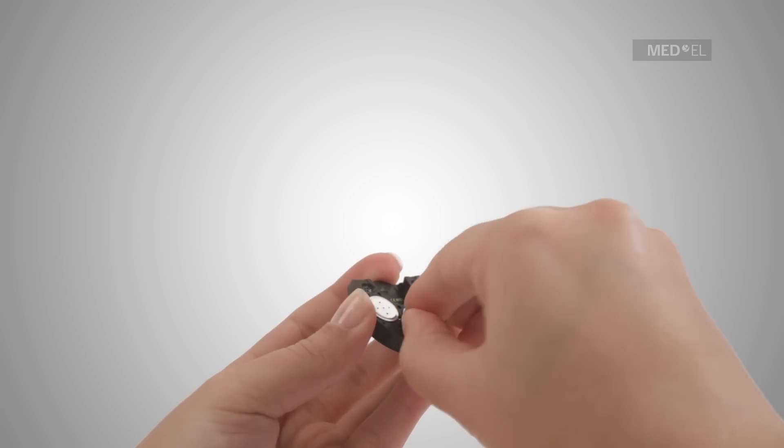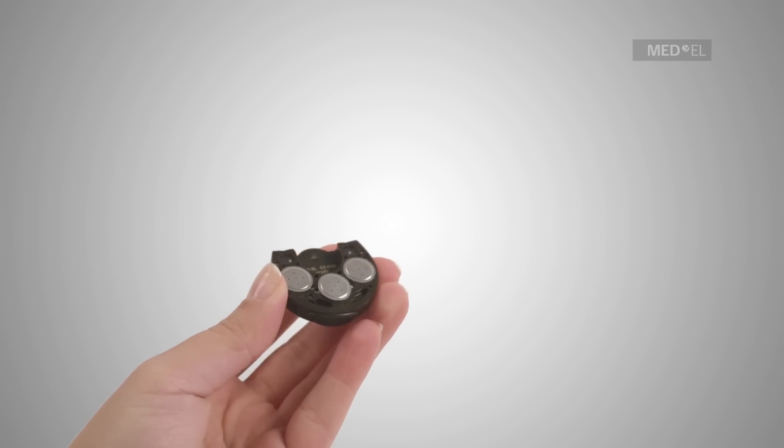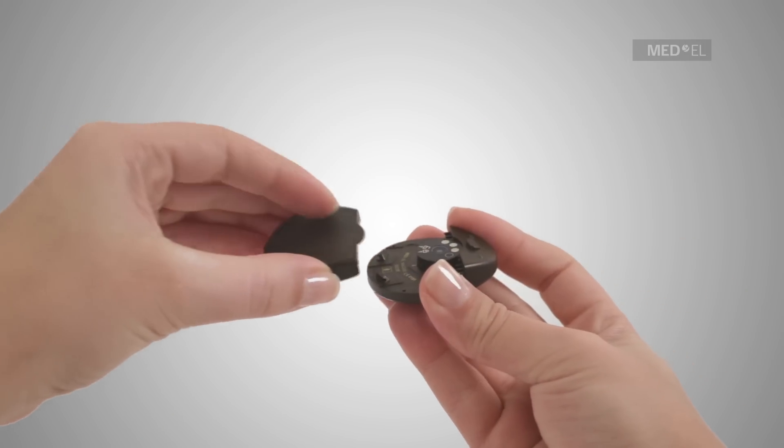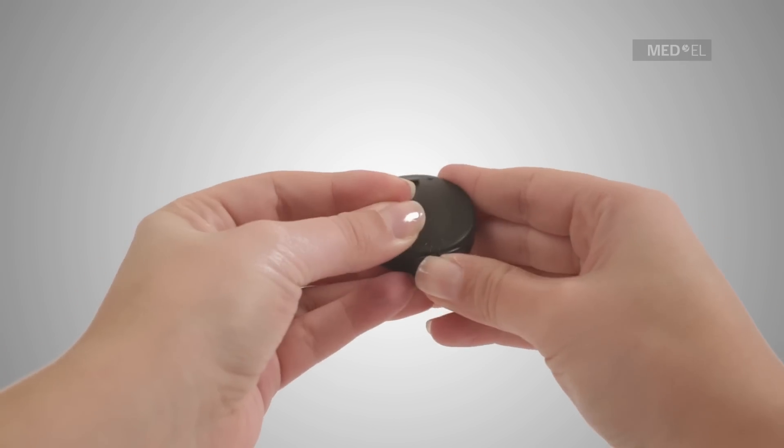To reattach the battery pack once the batteries have been changed, use the gently landing airplane method. The battery pack should come in at a slight angle against the back side of the control unit.